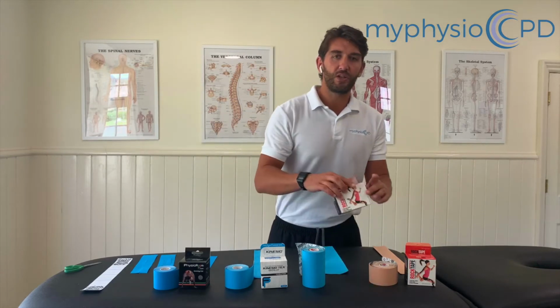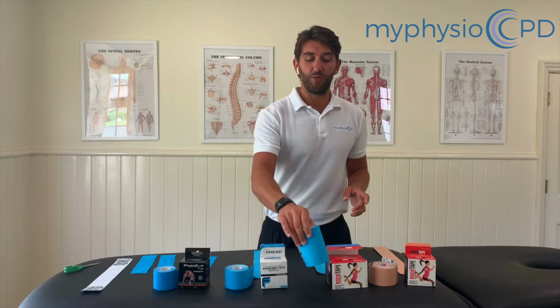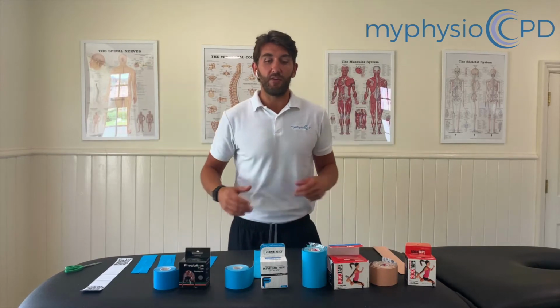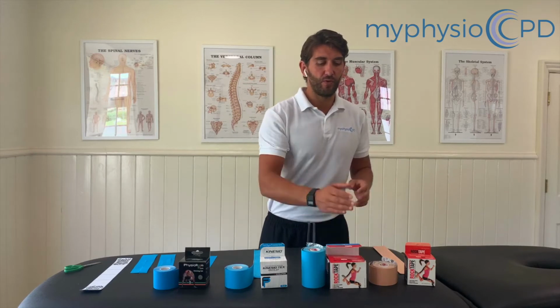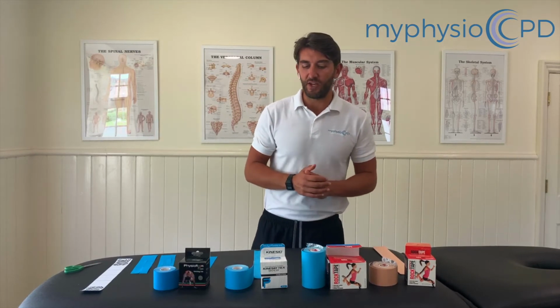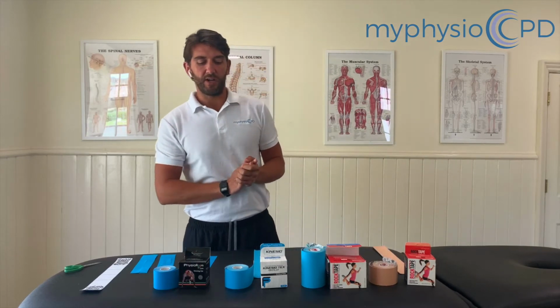This is another Rock Tape model, just a wider strip basically, and we'll look at the taping technique for that of the lower back. This roll was about £20 a roll, and they come in 5 meter lengths generally. This is 5 centimeters, this is 10 centimeters wide.